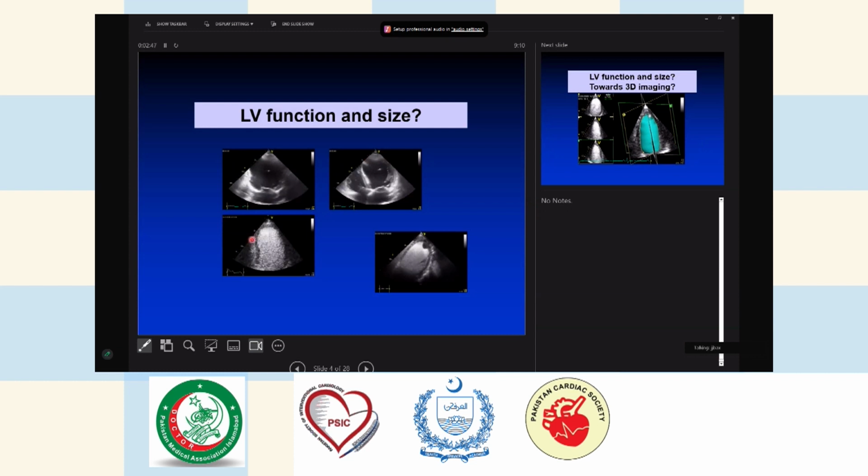For better understanding what is going on in the ventricle, if there is thrombi, etc., we give intravenous contrast. This is a different patient, but it's just to illustrate that with the contrast, we see so much better these contours that we can pick up immediately when there is a thrombus in this area. Here you see an example of that. This is another patient. Here is the left ventricular thrombus, very clearly to pick up when you do the contrast.